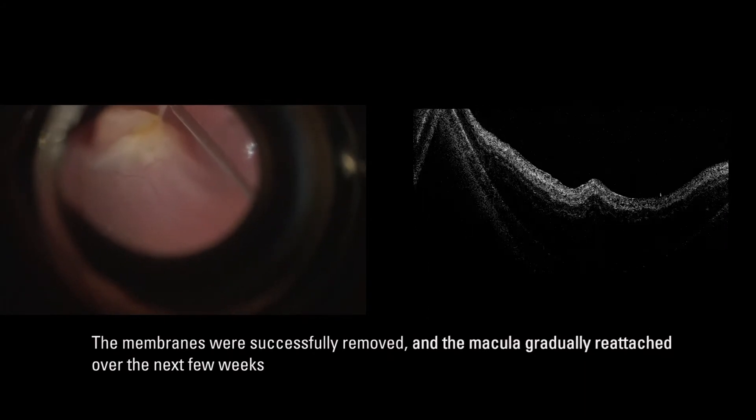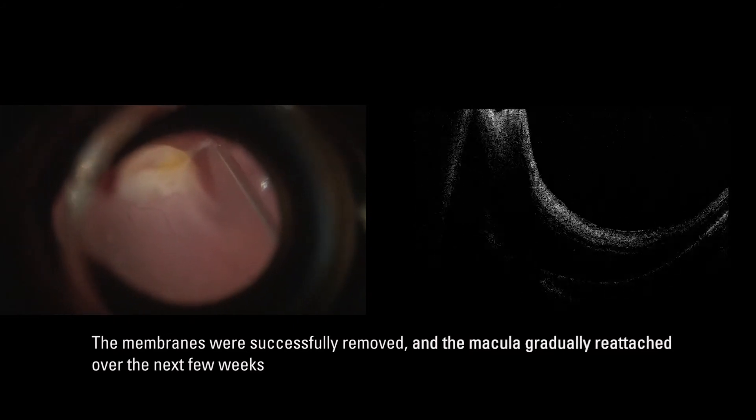The retina was scanned extensively after membrane removal to confirm all epiretinal and vitreous traction was released.